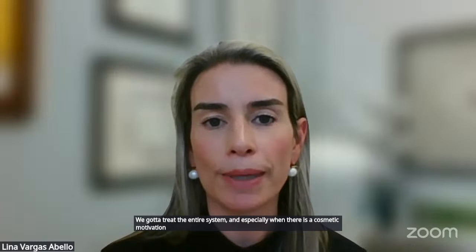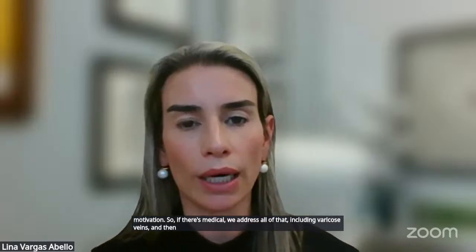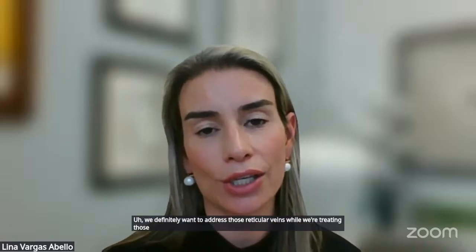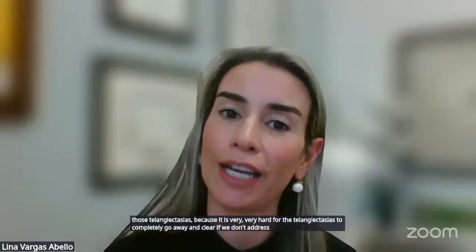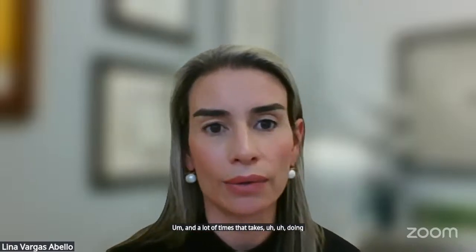So if there's medical, we address all of that, including varicose veins. And then as we jump into a cosmetic phase, we definitely want to address those reticular veins while we're treating those telangiectasias, because it is very hard for the telangiectasias to completely clear if we don't address the reticular veins that are feeding them. And a lot of times that takes doing an ultrasound.